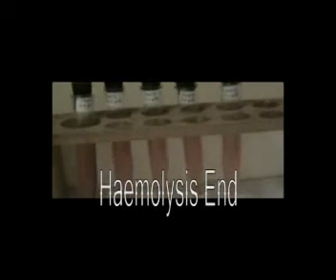And here, the 0.4 tube. Still there are some deposited cells at the bottom, and the next tube, 0.35. This is the tube with 0.35. You can see no color intensity difference and no deposited red cells at the bottom in the tube with the 0.35 concentration.